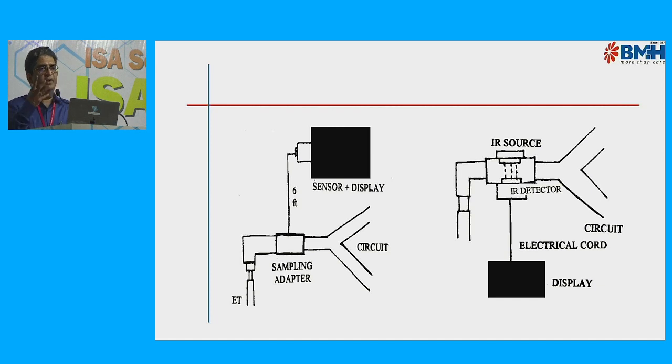How is it prevented in the mainstream? Sir, we have an additional heating property in the mainstream. Speak loudly so that it will be useful for others also. Sir, an additional heating property is there for the mainstream, maintaining the temperature above the body temperature, at 40 degrees Celsius, so that water vapor may not accumulate in it. Okay, so the rest of the students got that point. In the mainstream, you have to heat it to around 40 degrees centigrade to prevent water condensation.